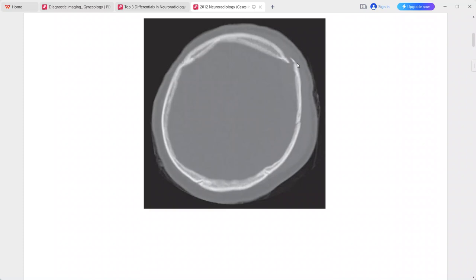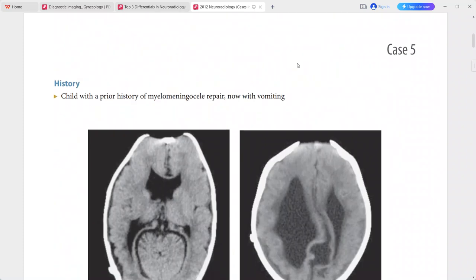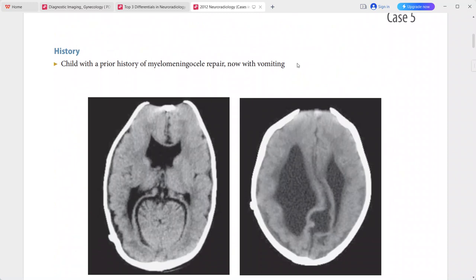This is a case of epidural hematoma secondary to the fracture. Differentials include subdural hematoma and meningioma. Management: epidural hematomas are managed surgically with evacuation.